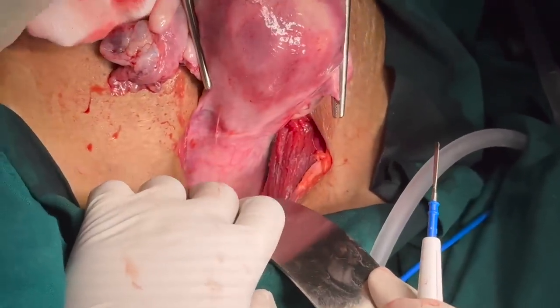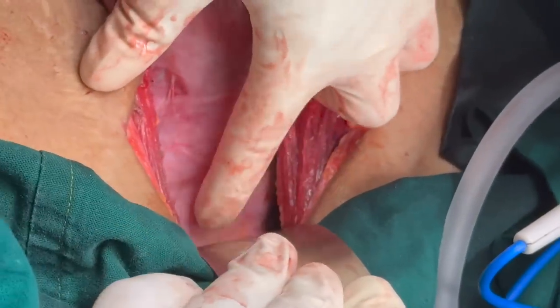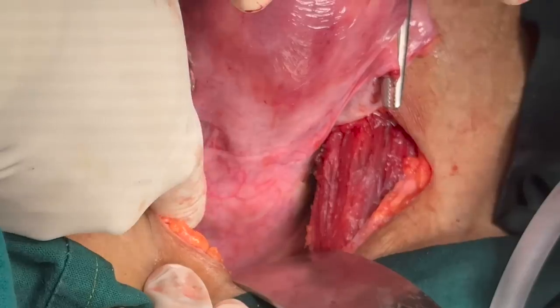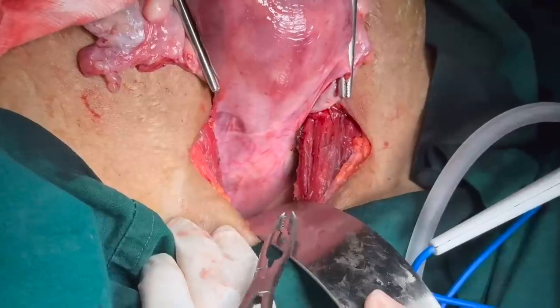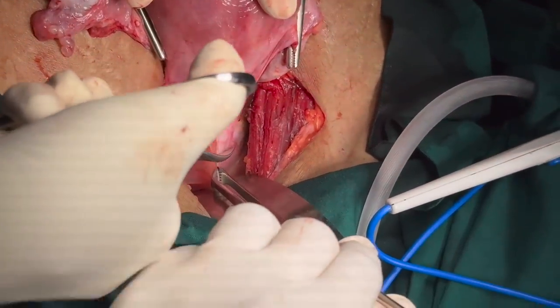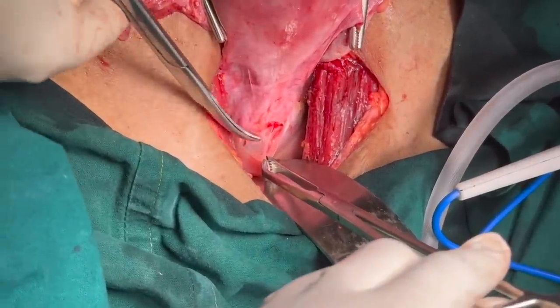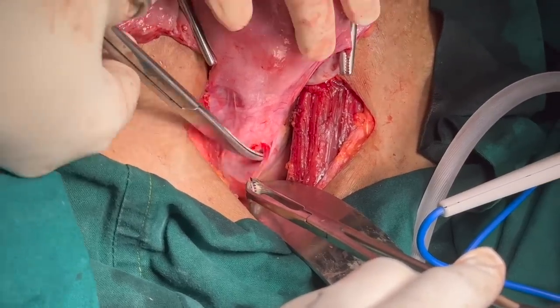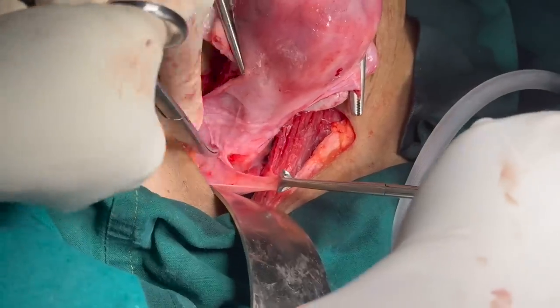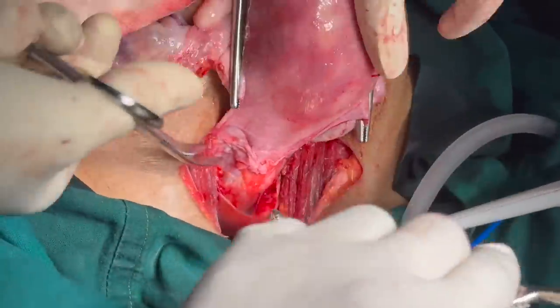Once you have taken care of the cornua on both sides, what you see here is the loose fold of peritoneum — the UV fold. Try to appreciate the bladder; the yellow fat will guide you. What you have to do here is just above the bladder onto the UV fold, give a nick. Hold the loose fold of peritoneum with Alice forceps and with the help of scissors, give a bold nick on this lifted peritoneum. Immediately you will see the loose areolar tissue. Go in that plane above the cervix on both sides, pushing the loose areolar tissue down, and reach on both sides up to the round ligament and the first clamp so the entire peritoneum can be pushed down.